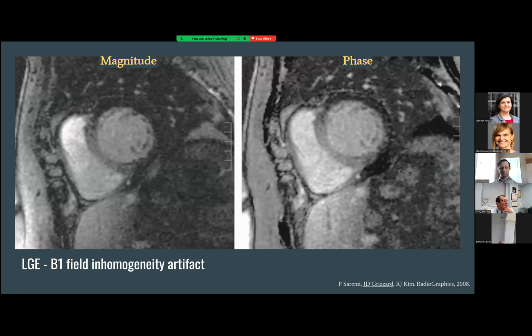So we're adding signal in the transverse plane and pulling those spins from the Z axis of our magnet up to the transverse XY plane. We have to set our pulses up so that they're doing that in a very uniform process. But if there's inhomogeneity in our B1 field, we could get some signal suppression in a non-homogeneous way as well.